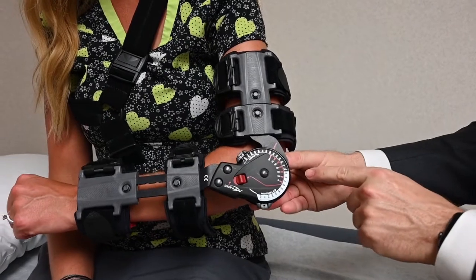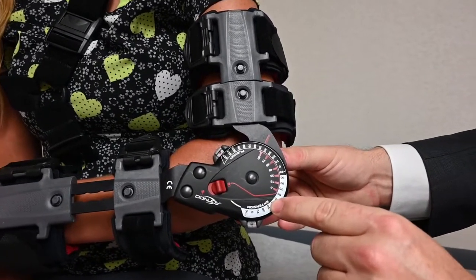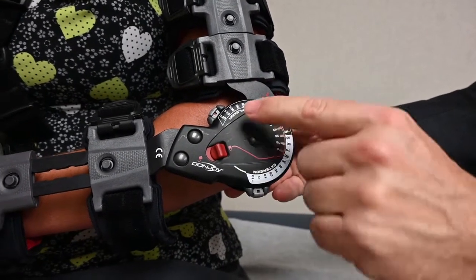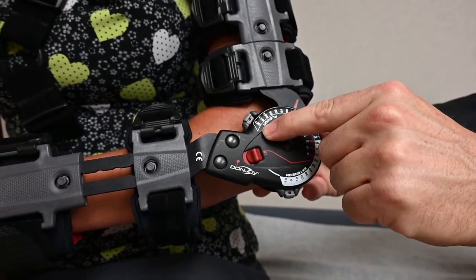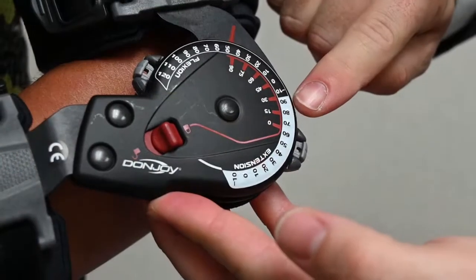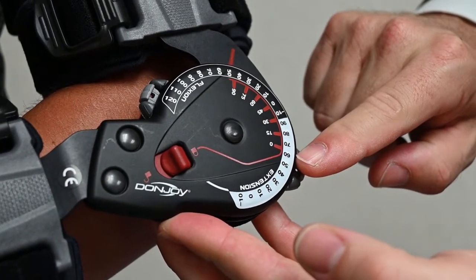There are two sides to the dial. The white side is labeled extension, and the black side is labeled flexion. We always set the flexion to full, which is 120 degrees. However, the extension is what we are going to slowly dial out.